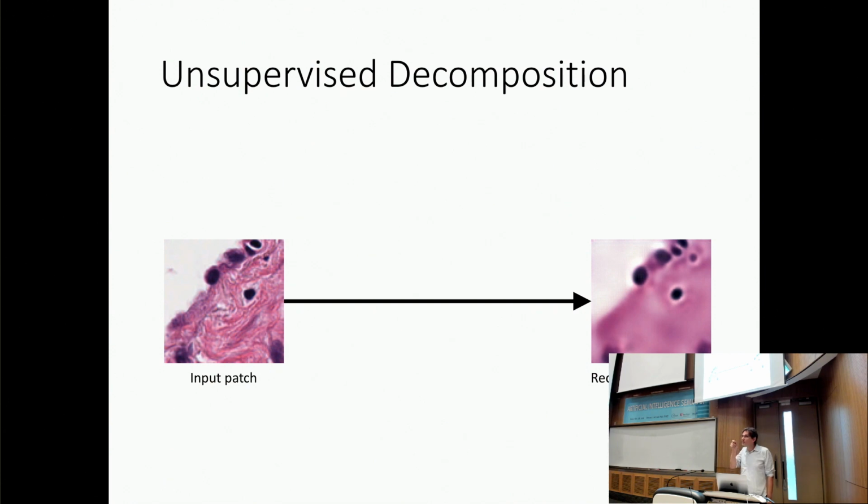Okay? The problem is that we don't have training data. In order to do this, a pathologist would need to sit there on the computer with a mouse and circle these lymphocytes for thousands of patches. Okay? In the United States, these doctors are paid about $200 an hour. Plus, it's really boring work. So you get them to do it, but they will do 1,000, 1,500. That's it. We need much more.